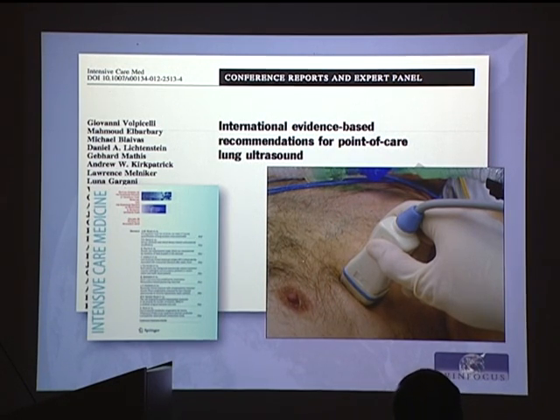So whatever we'll be mentioning in this lecture and the next ones about lung ultrasound is today based on strong evidence, and this has to be considered a best practice already. For example, after a thoracentesis or a central vascular access, to rule in or rule out a pneumothorax, ultrasound is not only an option, it's a must, because the evidence is telling us that it is much more accurate than X-ray to rule in and rule out a pneumothorax in a timely manner.